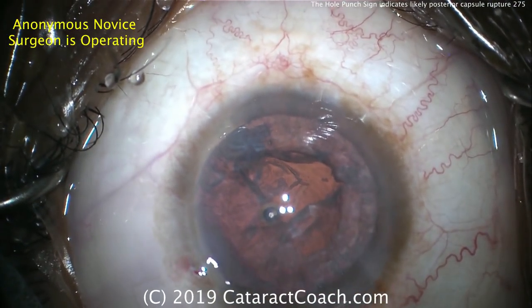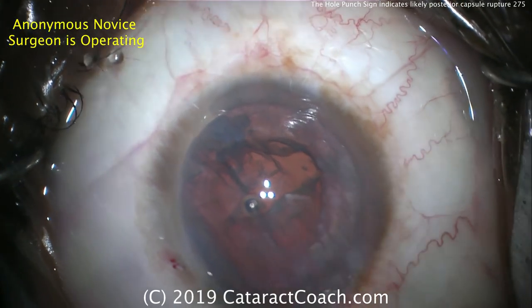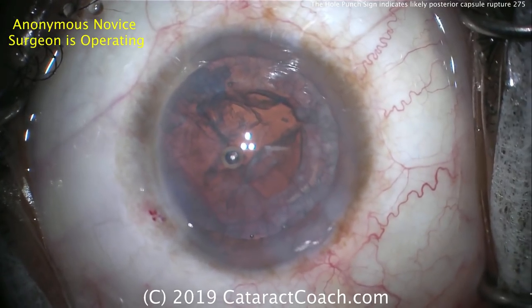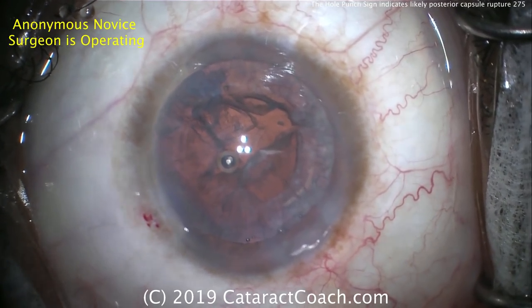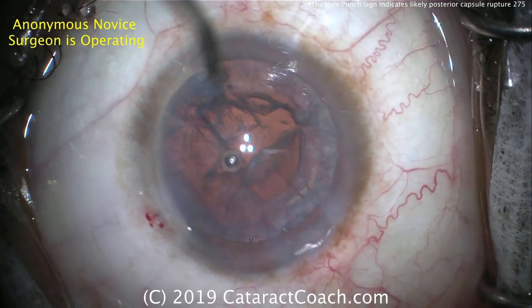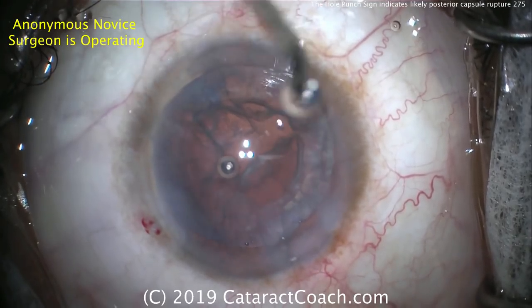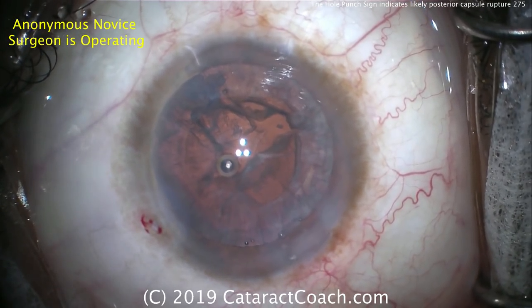Now you can come out — that was good, that was a good job. So what has to be done now? You know there's a hole in the posterior capsule and you still have to remove the lens cortex. At this point, I would encourage you to use the bimanual anterior vitrectomy setup to do the removal of the cortex.